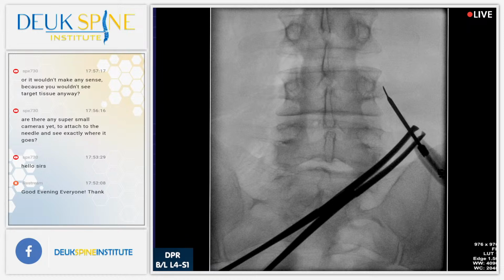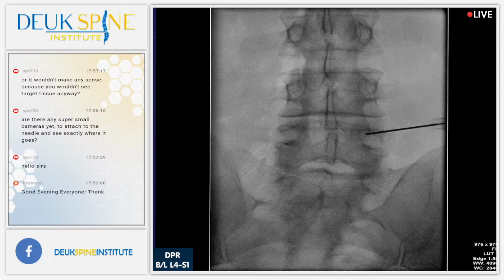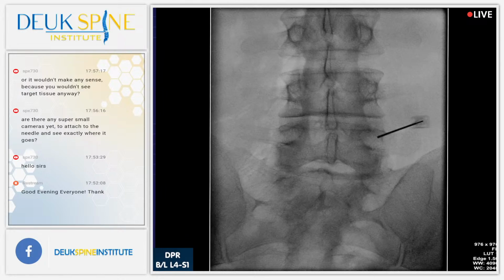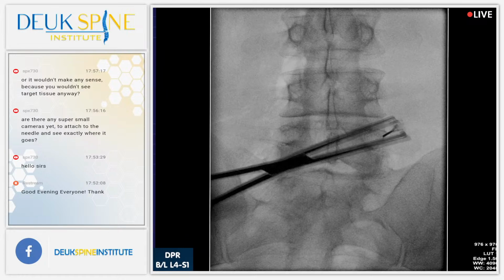Next we go down to the L5 TP, where you have the L4 dorsal ramus. Shot, to medial, shot. It's a little bit better. Any other questions? No current questions. So it's just a methodical process of shot. Yep, that's pretty damn good right there. That's as good as it gets.